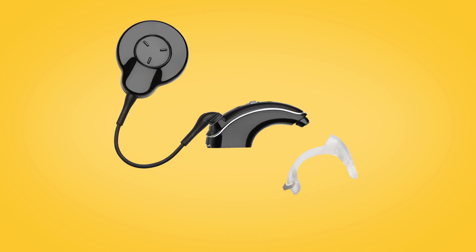Clip the earhook end first, followed by the metal hook at the battery end.